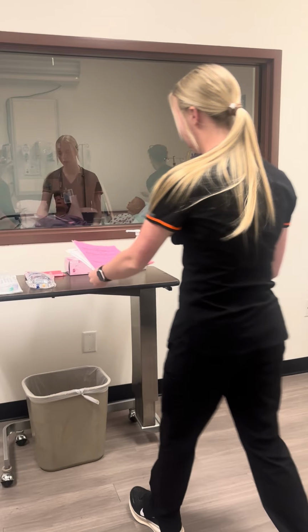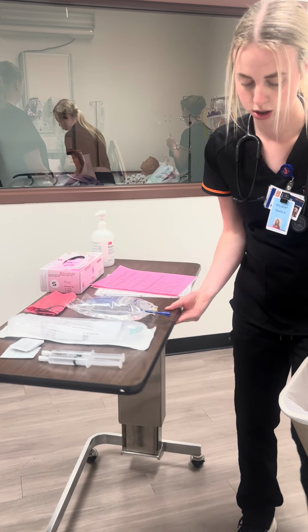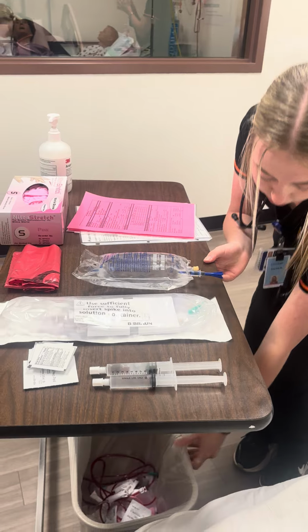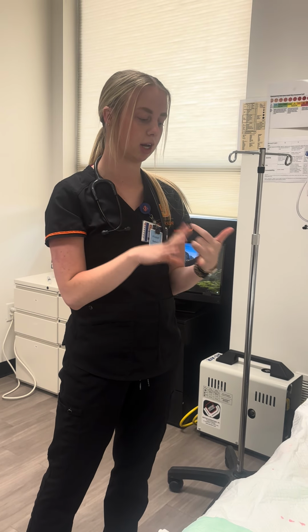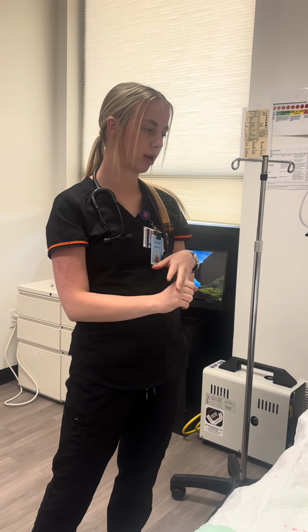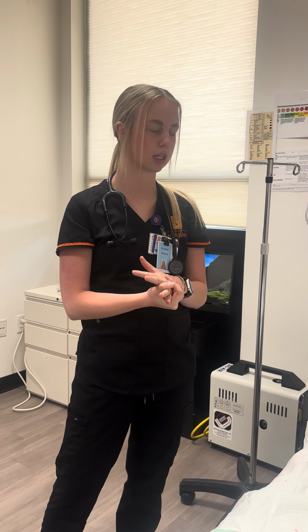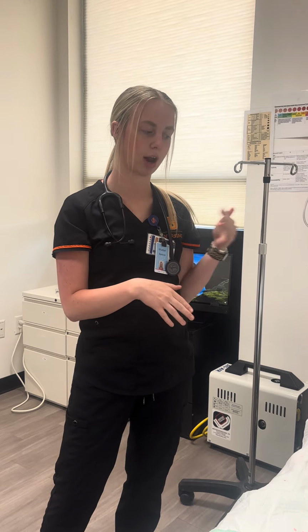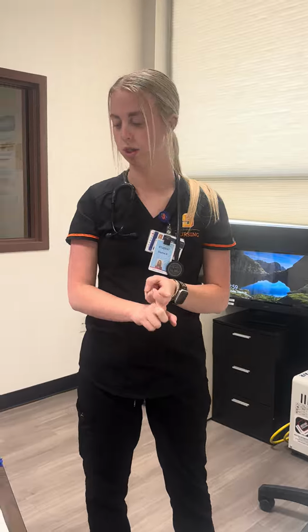I'm just going to come over here and grab all of these things. So, I'm trying to make sure I'm not missing anything. If we were to administer meds, if the patient needed a diuretic or any type of medication before giving the blood transfusion, we'd want to ensure that we gave that 30 minutes before the blood to ensure that it has the time to do what it needs to in the body and not have any adverse reactions with the blood.